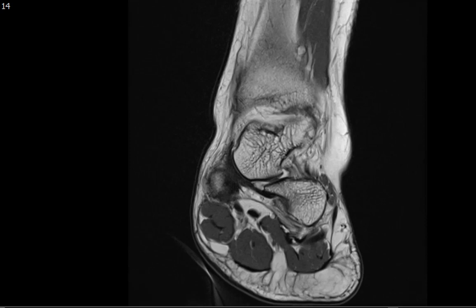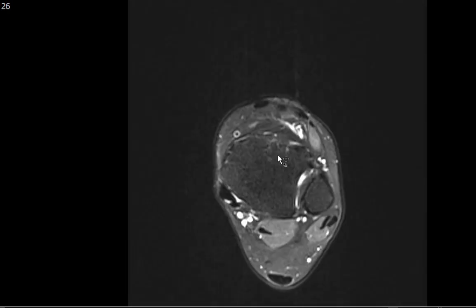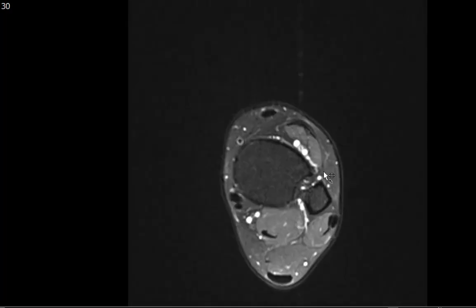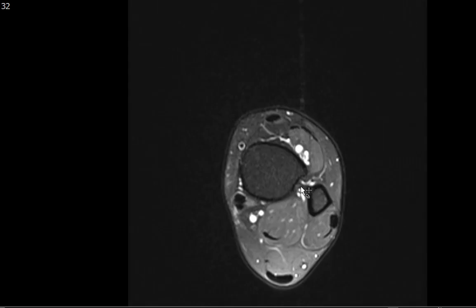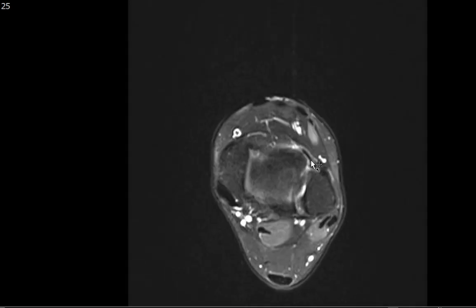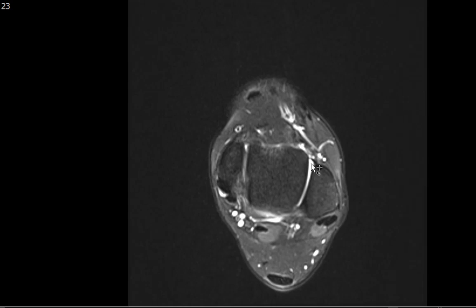I then turn to the axial images — the axial T2 fat sat weighted image — to finish evaluating the ligament structures. Starting at the most superior slice, there is the interosseous membrane between the distal tibia and fibula at the level of the tibiofibular syndesmosis. Coming down, the first hypointense structures coursing between the tibia and fibula are the syndesmotic ligaments: the anterior tibiofibular ligament and the posterior tibiofibular ligament. These are normal — nice hypointense structures with minimal striations along the posterior tibiofibular ligament, totally normal.